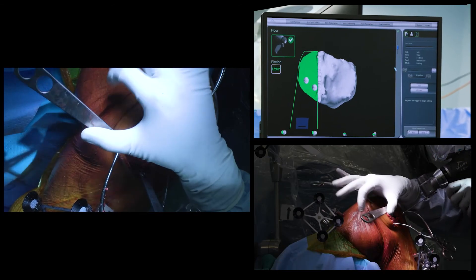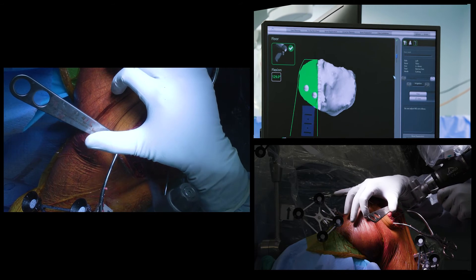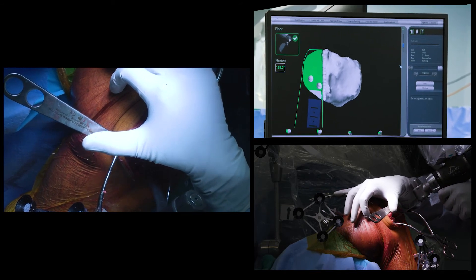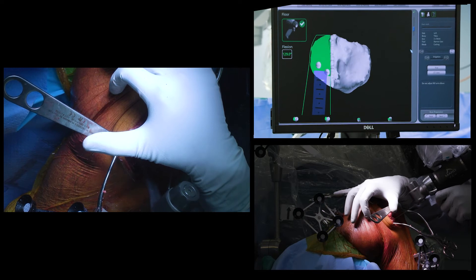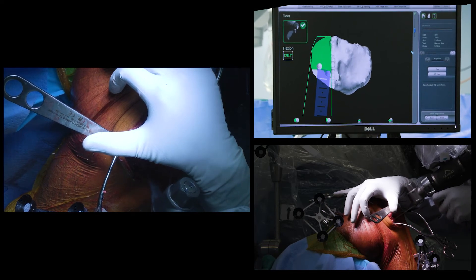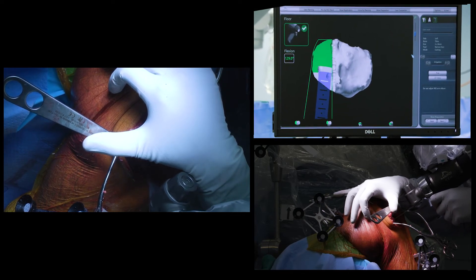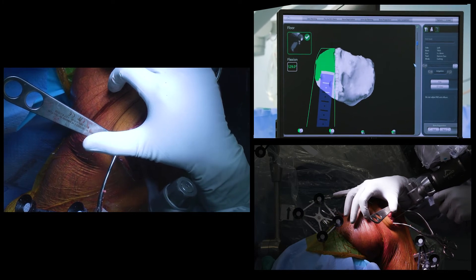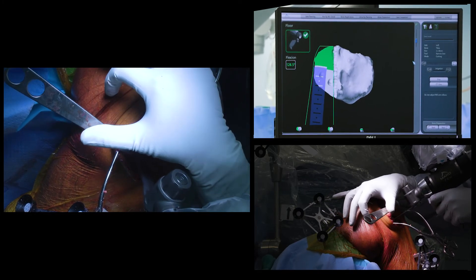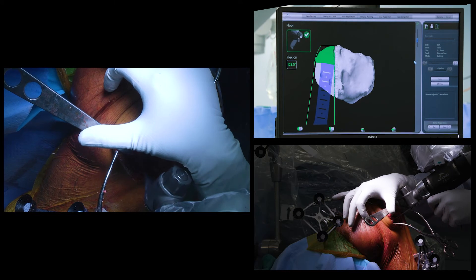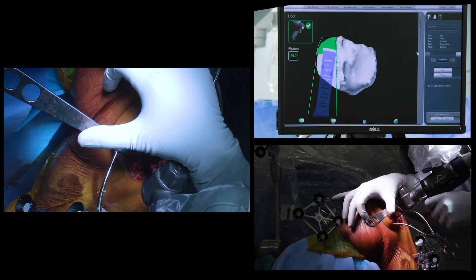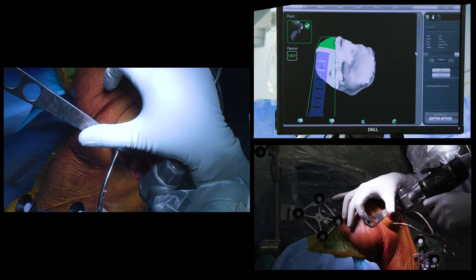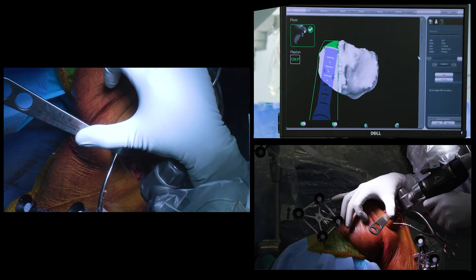Once all the bony cuts had been completed, I felt that not enough bone had been removed from the proximal tibia. The beauty of this system is that if needed, as little as one millimeter of bone can be removed from any bony surface at any given time. Here, I was able to use the accuracy and precision of the robot to go back and cut a further millimeter off the proximal tibia.